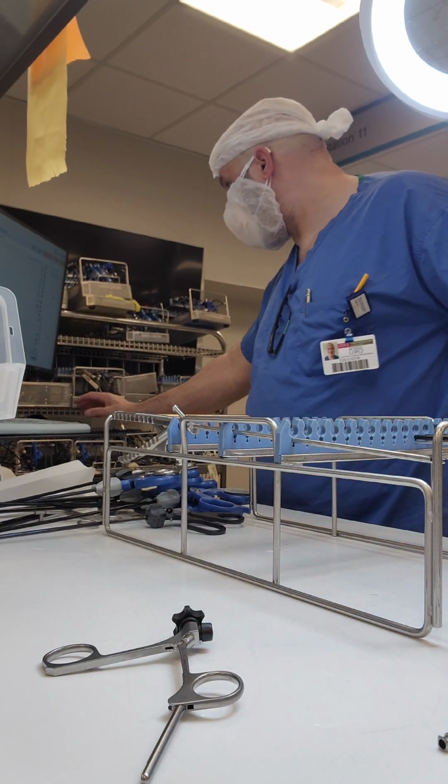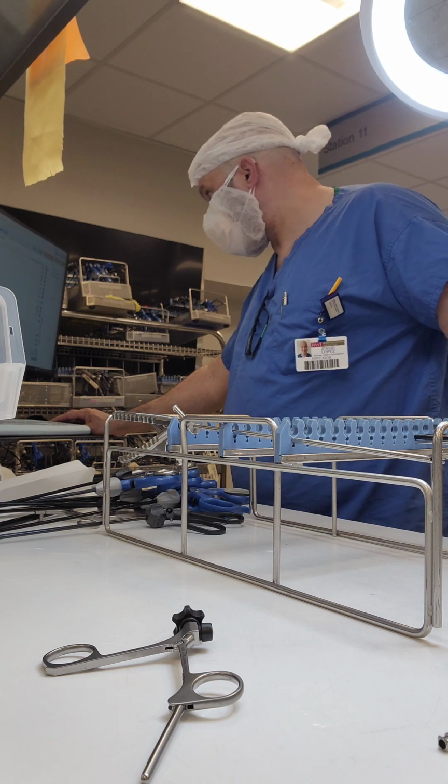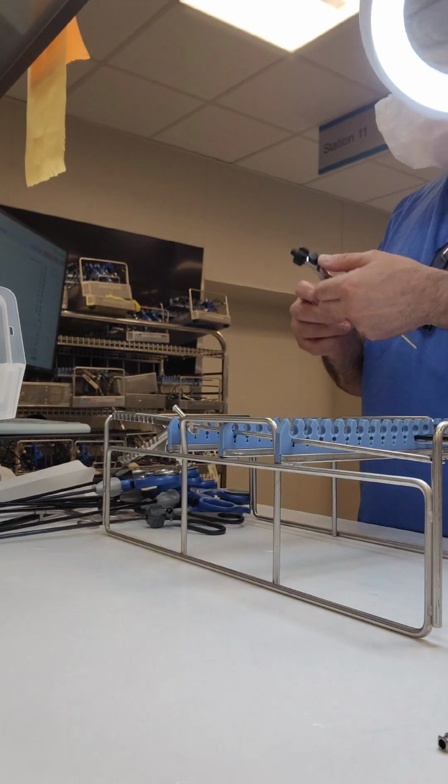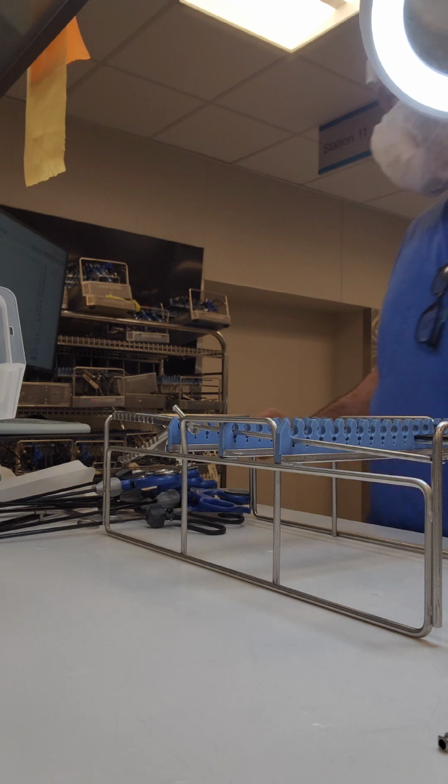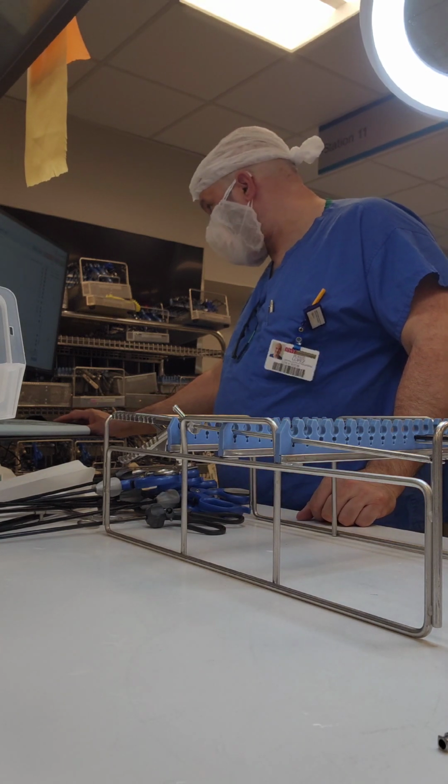So I do show you the damage here. It was actually missing a button on the top. Flip that off to the side. Check off the next one. Making sure that button works. Make sure that the collar's around there. I place that in the bottom of the basket.